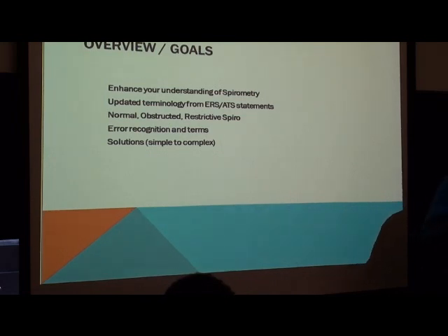regardless of site. We're now in an era where a lot of patients are first seen out at the satellites, then brought to the main campus for whatever reason, maybe a diagnostic procedure, and then seen on follow-up at the family health centers again. It really is not a good idea to have recognizable differences in the results from one testing station or testing site to the next that are not attributable to the patient. We want those changes to really reflect that patient's status.